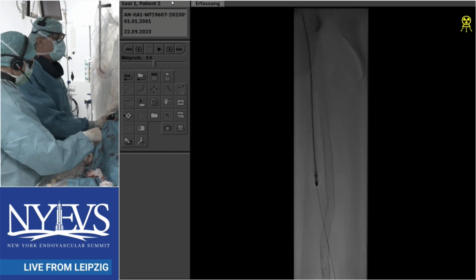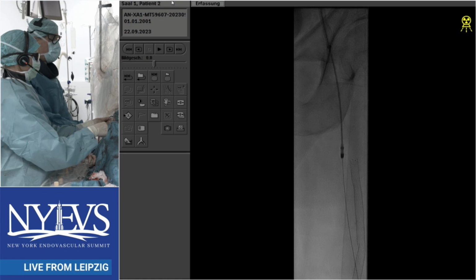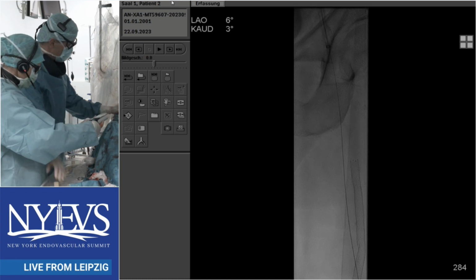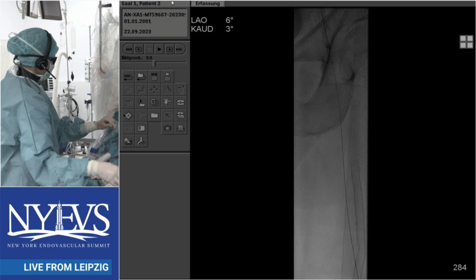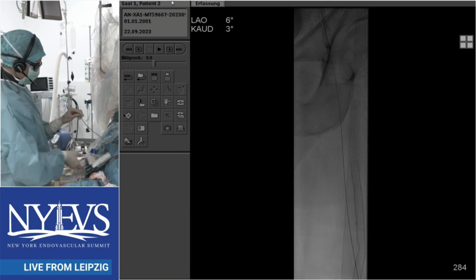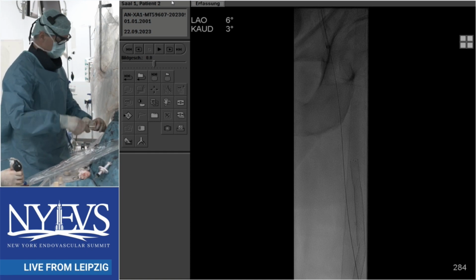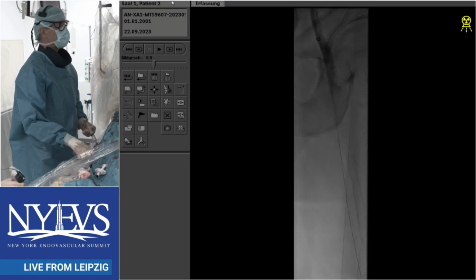I just want to clarify. So there was a prosthetic bypass, PTFE, 6 to 8 years ago, and then a recent vein graft. Correct. And the target of the below-knee vein bypass was below the knee. Yeah, PTFEs across the knee don't do well. Exactly, veins above and below the knee do well. But he's in the above-knee PTFE. So Andre, just a question: were you on the on mode as you withdrew the Rotarex as well? You were doing both. Yes, correct.